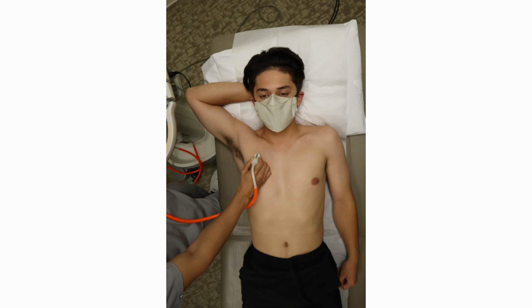So you're going to go on the patient's chest, you're going to have the probe indicator up to the patient's head, and it's going to shoot a beam between the lungs and take a slice of the lung parenchyma. And it's going to show some subtle findings that will tell us if this patient's lung potentially has a pneumothorax.